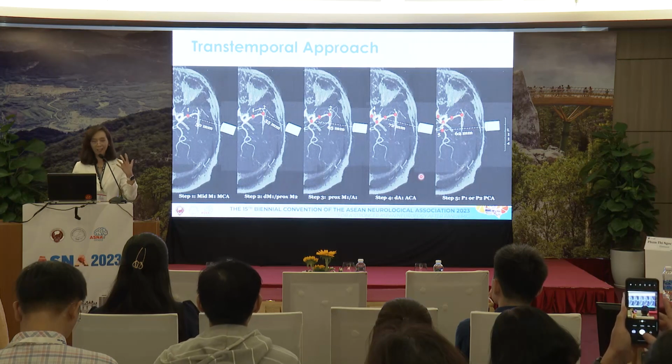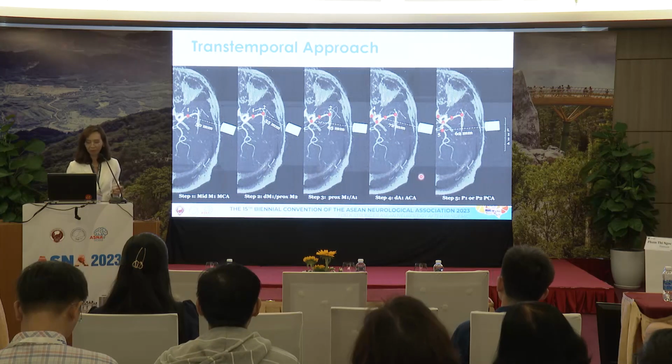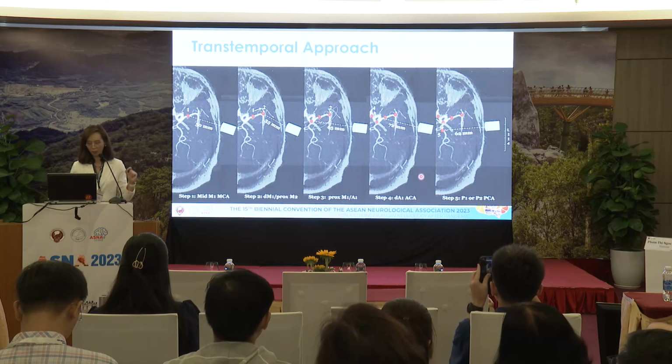So this is, as I said, blind. You can't see the picture. You just have to imagine the anatomy by yourself. So this is what we usually do, find the arteries like this.